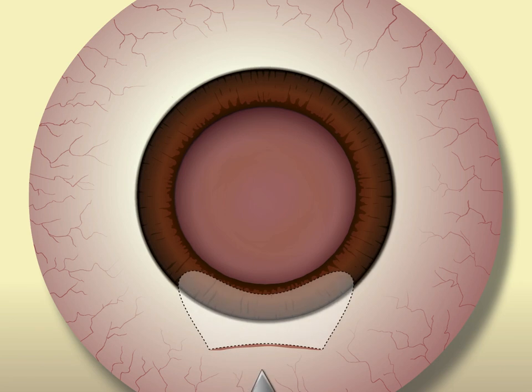The next step is to enter the anterior chamber using a keratome. Many surgeons prefer to make a 3 mm internal incision first. This allows the surgeon to have better anterior chamber maintenance during the creation of the anterior capsulotomy. But whether you start with a 3 mm entry or open the internal incision completely before creating the anterior capsulotomy, take care not to lose the internal corneal shelf that you've made by entering the anterior chamber prematurely.